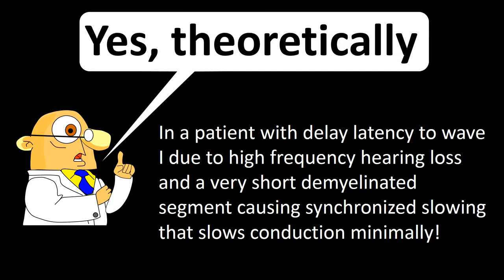Theoretically, the answer is yes, but it has to be a very peculiar situation. The patient must have a high frequency hearing loss and a very restricted lesion producing minimal slowing of the brainstem pathways, so as to be compensated by the delay in wave 1 which is out of proportion to the delay of wave 5 in patients with high frequency hearing loss.